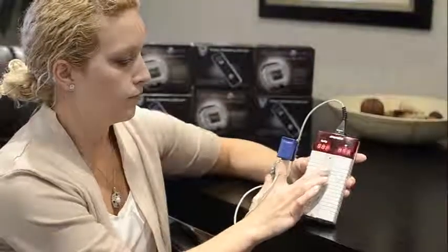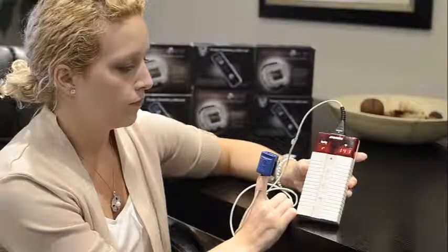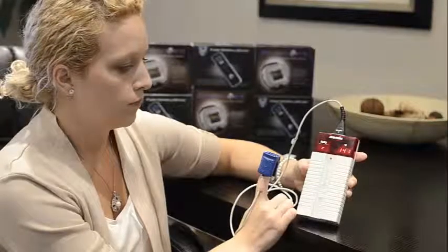Step 4: turn on the device by pressing the top button. The device will light up and numbers will display.